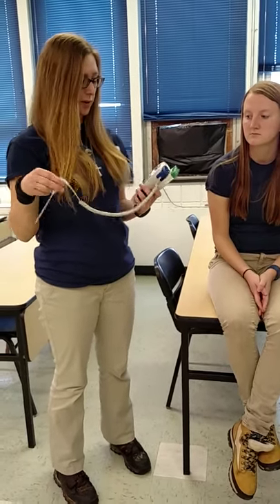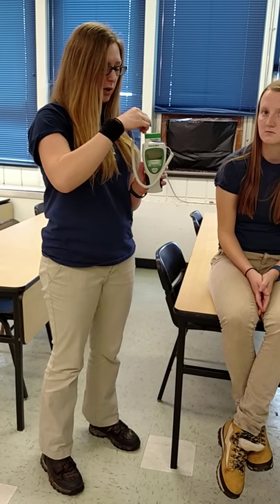Okay, we're going to be taking an oral temperature with an electronic thermometer. So, first you put a probe cover on it.